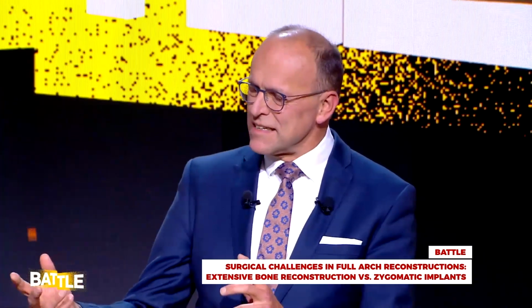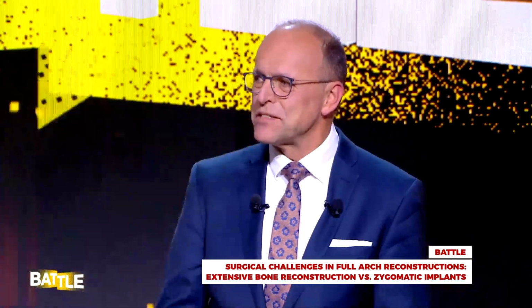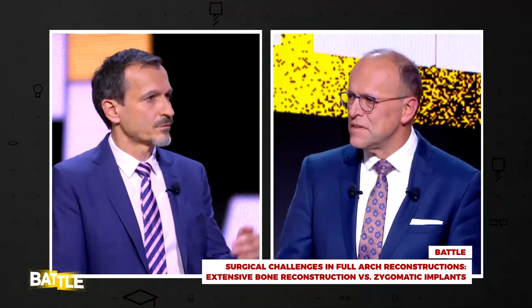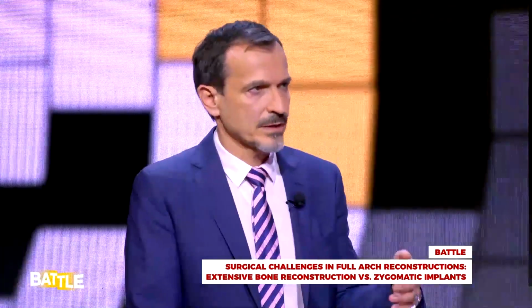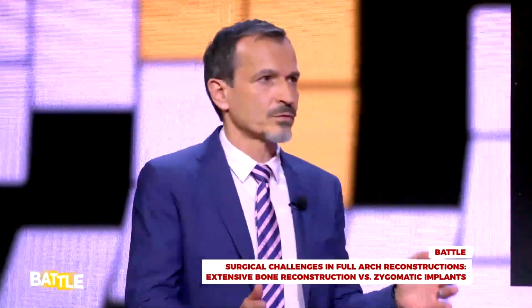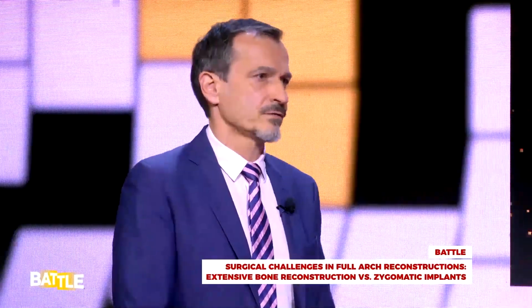But would zygoma implants then be an option for the frail patient, the patient that is unfit for major surgery? Yes, of course. If you look at these patients that are not fit or very old, the surgery takes us about 2.5 hours as an outpatient treatment in general anesthesia, which is quite acceptable for these old people as well. So, I mean, this is one option just to bring them back to a better quality of life.